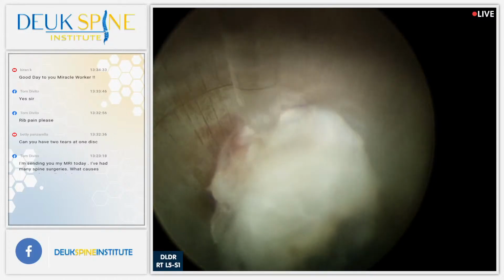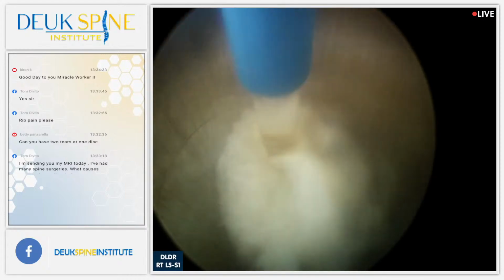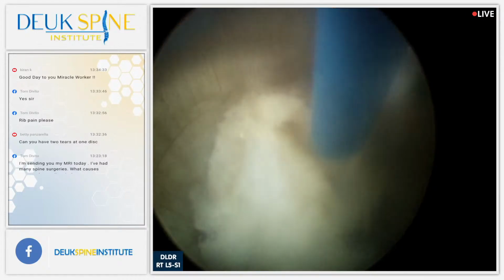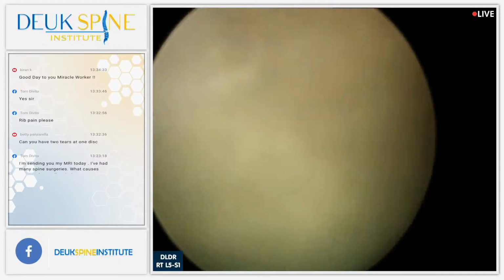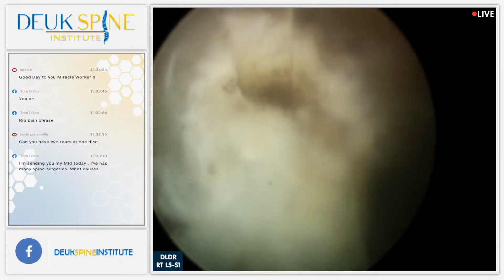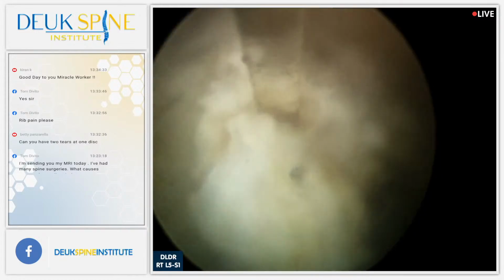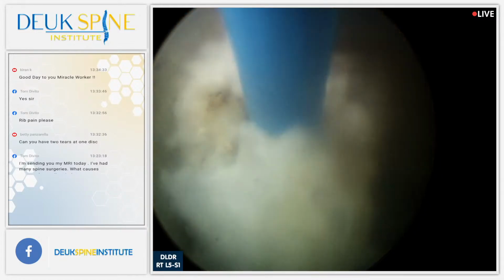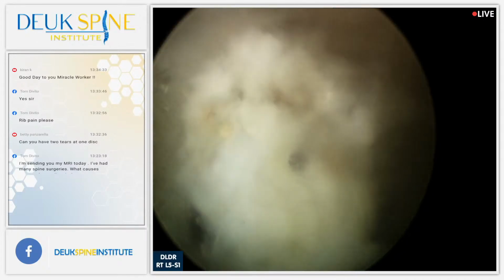Right, Luis? This is the herniation right here. You guys can see the white stuff is scarred herniation. It's really thick. Anyway, the laser itself is 1 millimeter wide, the glass. And you can see I'm moving it around. That's me moving it, by the way, the surgeon.